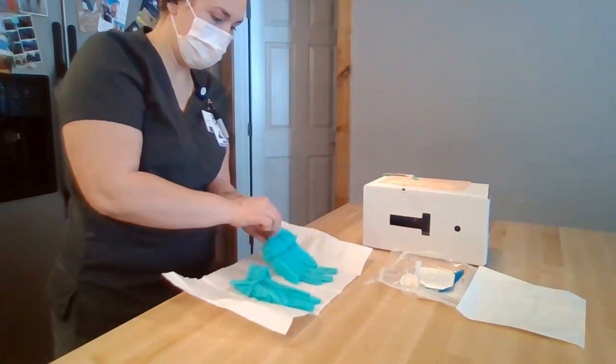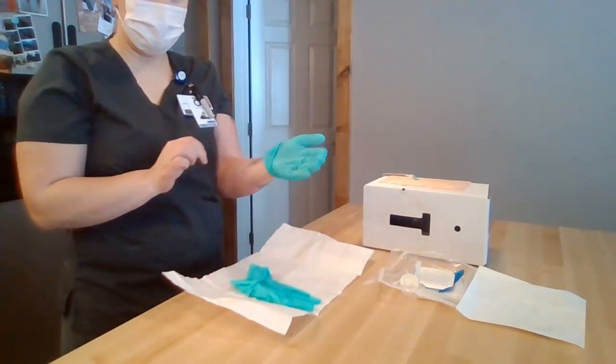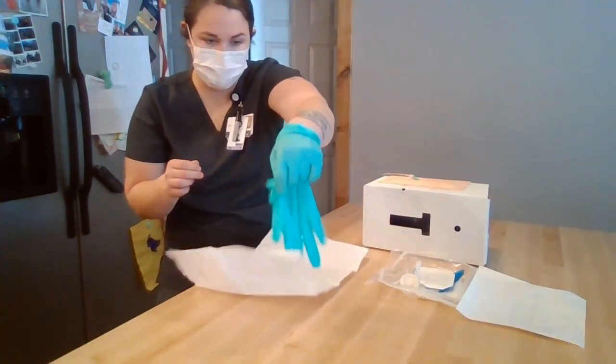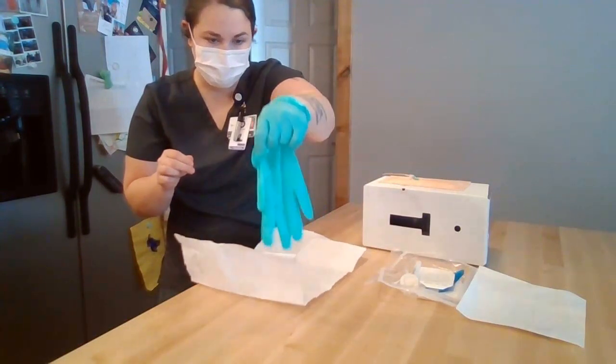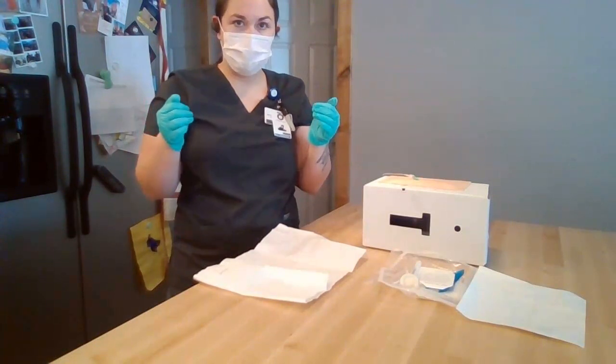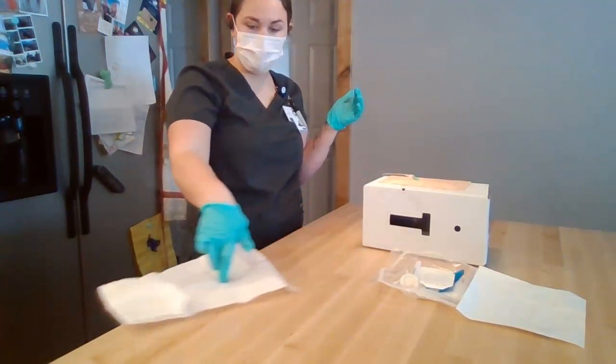I'm going to pinch the inside of the cuff and flip it on. Then I'm going to put my fingers on the inside of the other cuff and put it on. Now that that's done, I'm going to touch only the sterile part and throw the packaging in the trash.